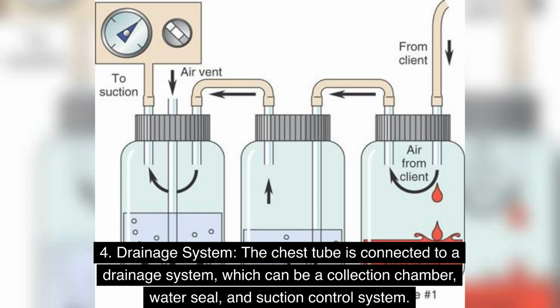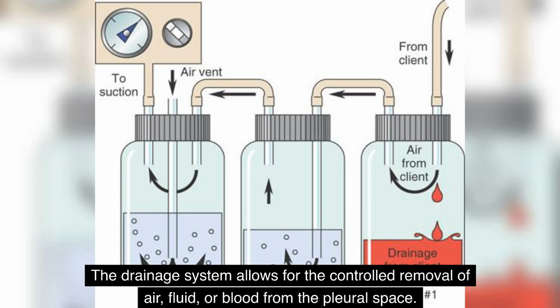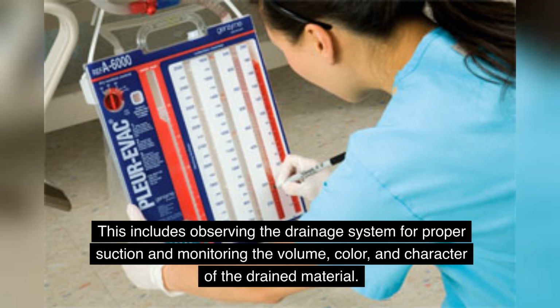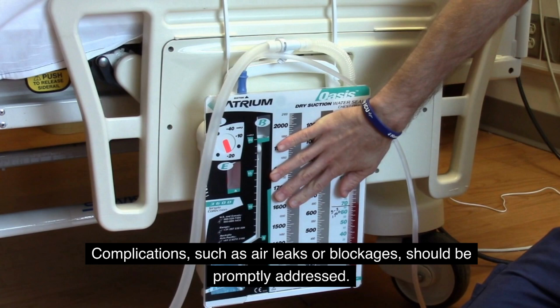4. Drainage system. The chest tube is connected to a drainage system, which can be a collection chamber, water seal, and suction control system. The drainage system allows for the controlled removal of air, fluid, or blood from the pleural space. 5. Monitoring and management. Nurses and healthcare providers monitor the chest tube to ensure it is functioning properly. This includes observing the drainage system for proper suction and monitoring the volume, color, and character of the drained material. Complications, such as air leaks or blockages, should be promptly addressed.